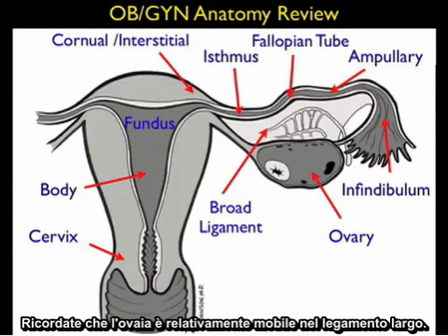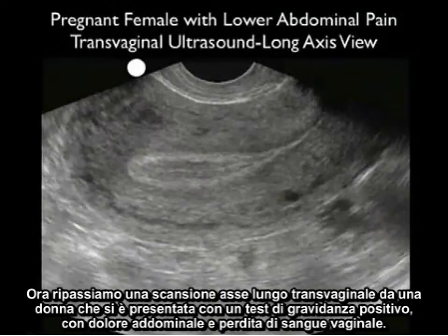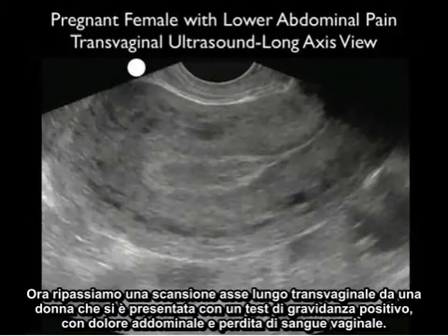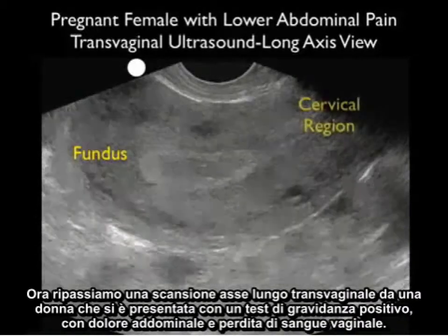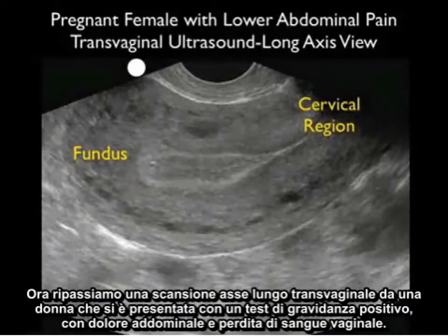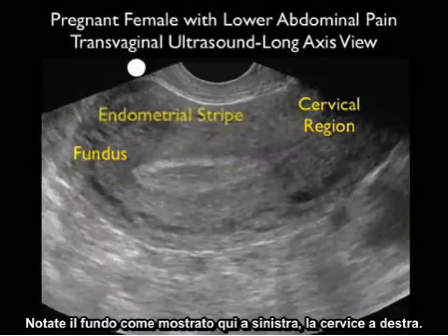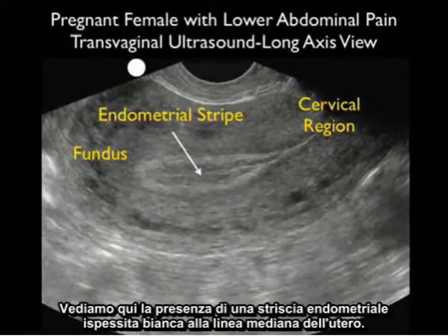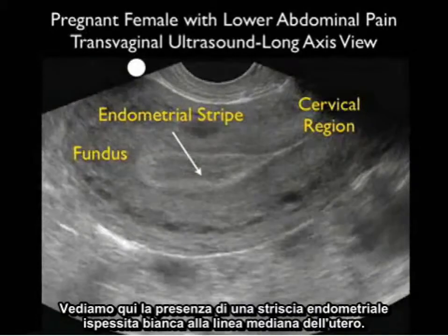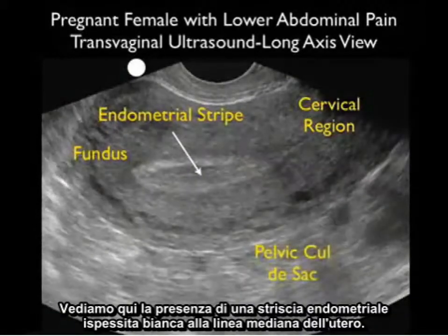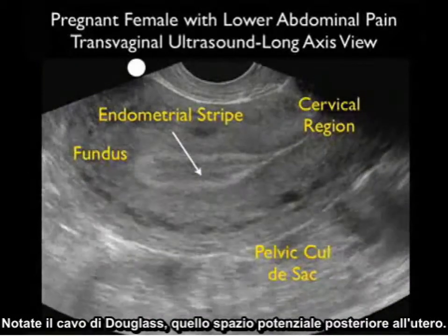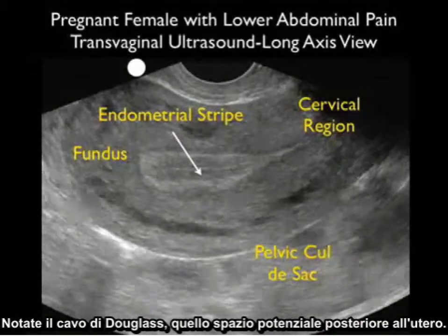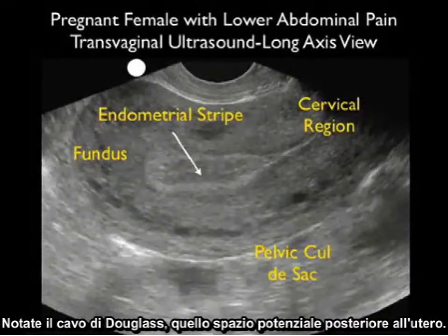Remember that the ovary is relatively mobile within the broad ligament. Now let's review a transvaginal long axis scan from a woman who presented with a positive pregnancy test, lower abdominal pain, and vaginal bleeding. Notice the fundus shown here to the left, the cervix to the right. We see the presence of a thickened white endometrial stripe in the midline of the uterus. Notice the pelvic cul-de-sac, that potential space posterior to the uterus.